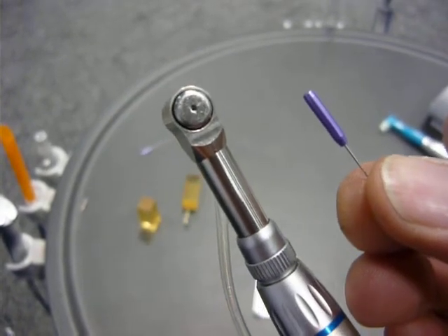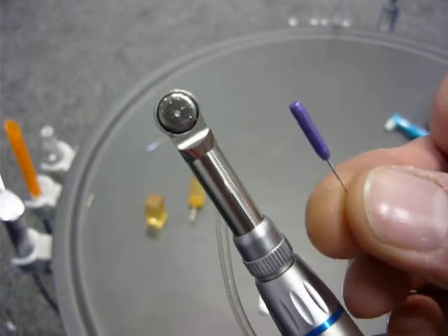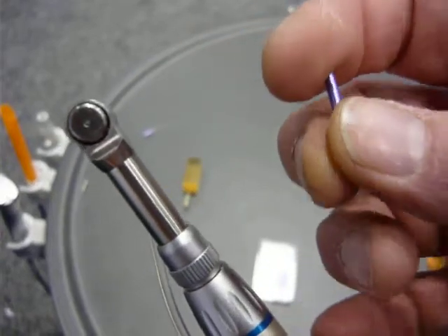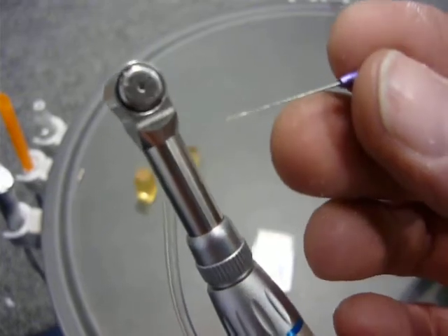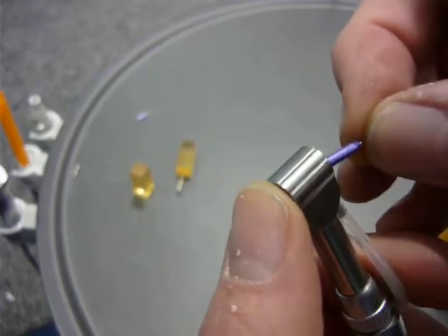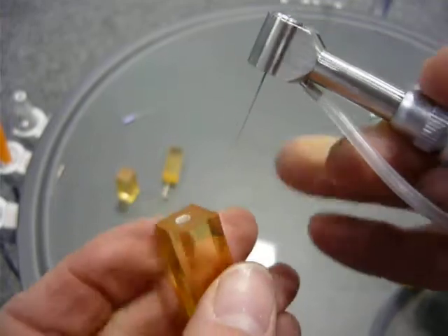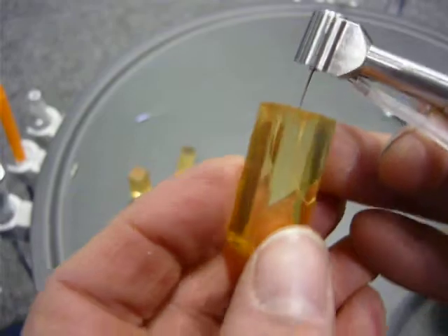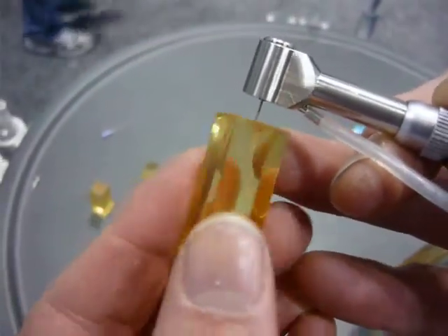This is a demonstration of Endo Technique's Endo Pulse vertically reciprocating handpiece using master files. Today we're using a number 10 stainless steel modified Hedstrom file with a rounded tip, and we will attempt to break this file in a plastic block. We'll be running the file at approximately 8,000 to 10,000 RPM.